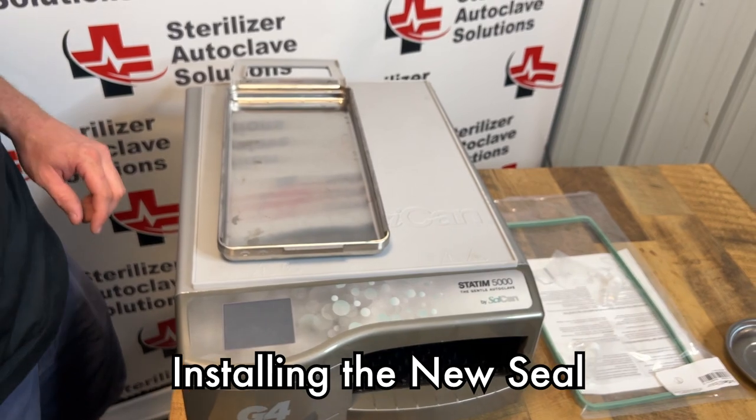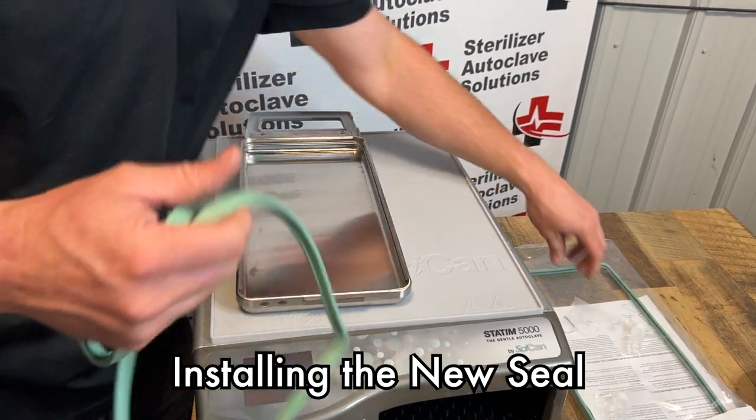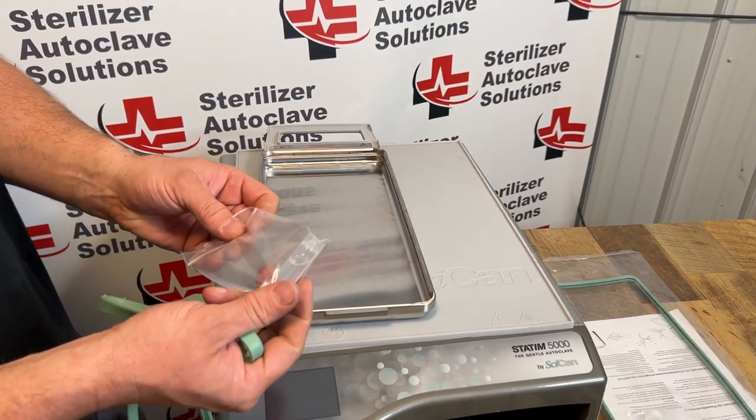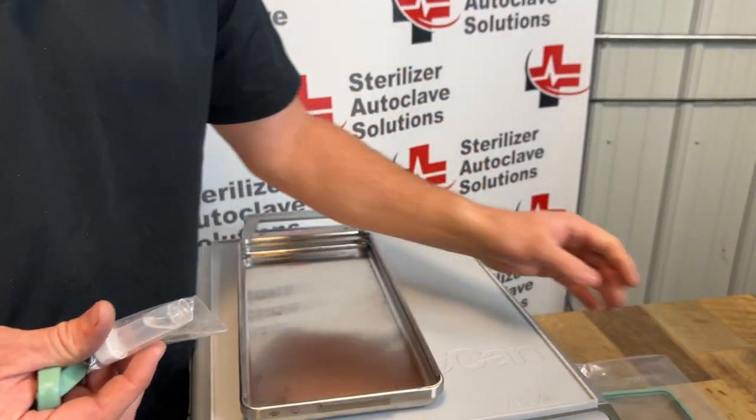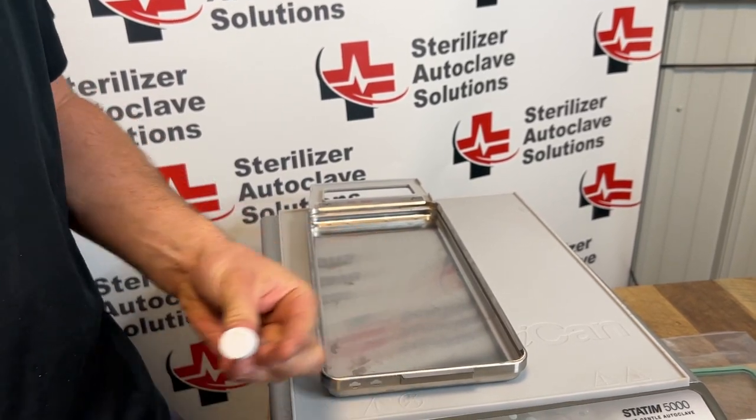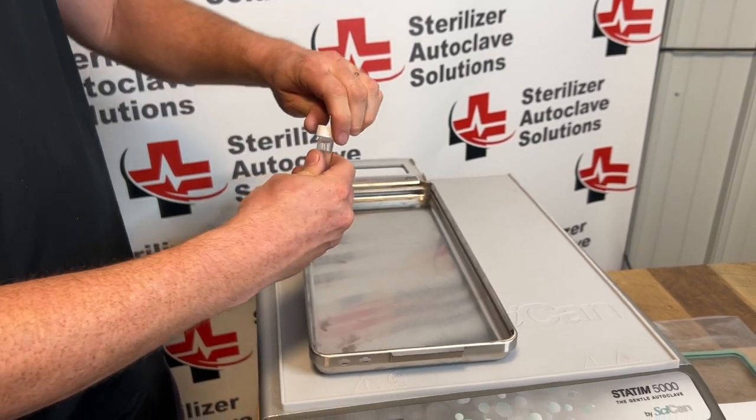I'm actually going to be reinstalling this same seal. First, there is a provided lubricant that comes with your new seal. I'm going to take about half this lubricant and pour it into the middle of this tray.